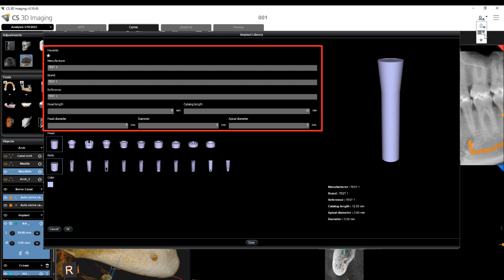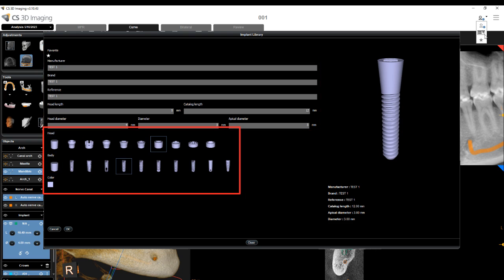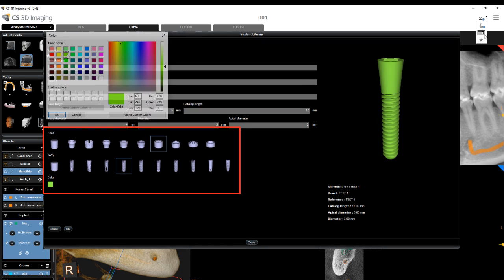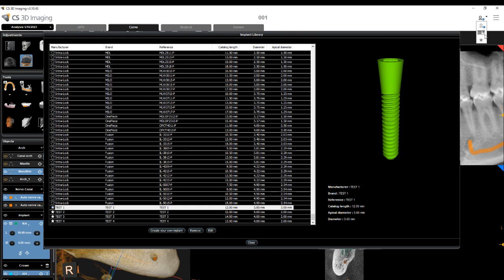Specify the manufacturer, brand, reference, length, apical diameter, and diameter. Then use the head, body, and color picker to configure the shape and color of the new implant. Click OK. The new implant is added to the implant library.